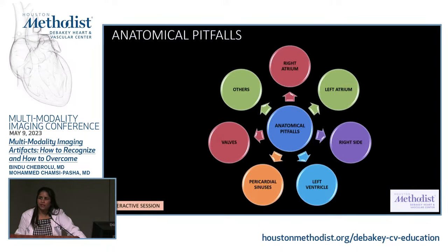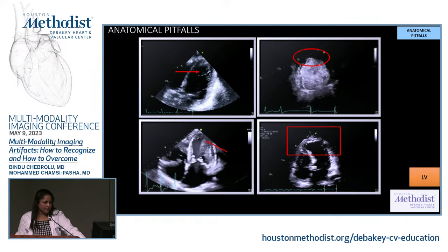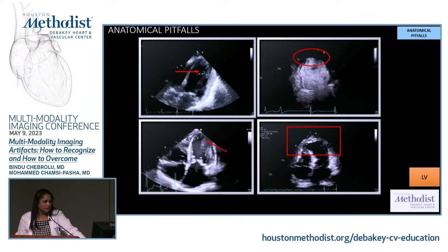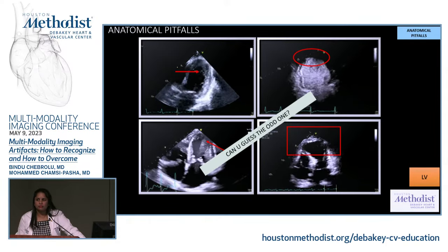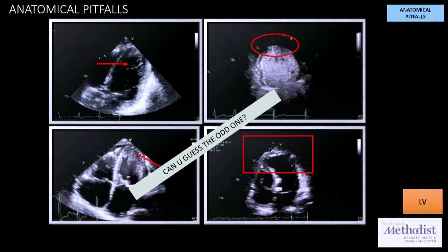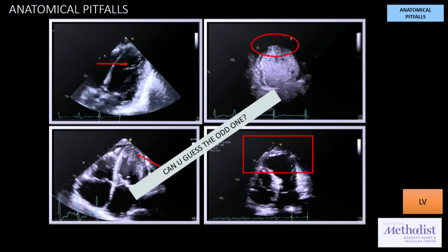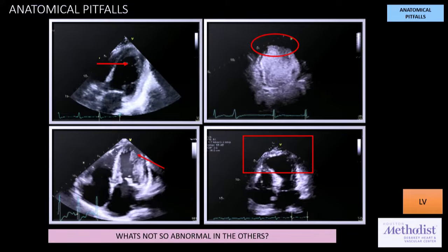All right, who's next? Priscilla. He says ready. LV. All right. So let's take some time. I'll also show you what I'm showing. Can you guess the odd one? Yeah? Right? I think I hear the answer already. Guesses? Fourth one, right? Yeah. All right. So you got the answer, but what's not so abnormal with the others?